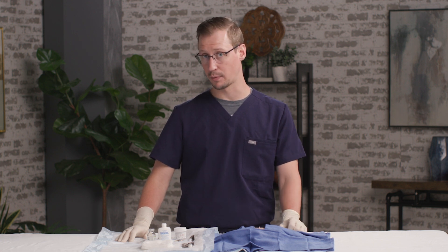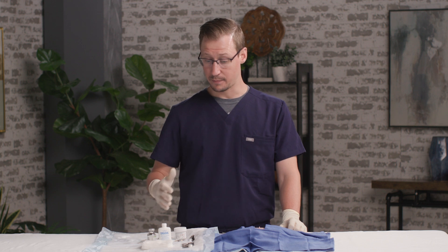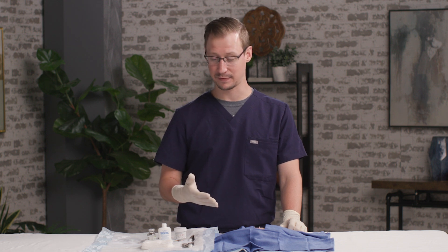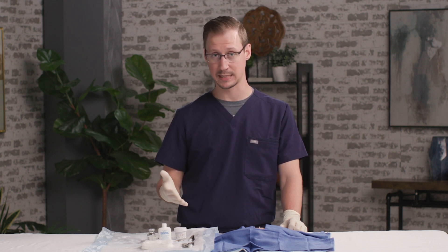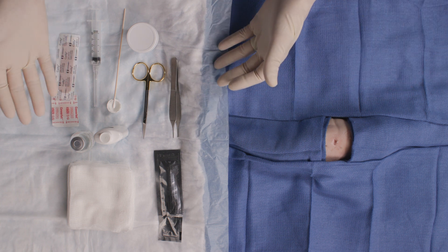This is a really straightforward procedure — the snip excision technique. First, of course, we would do our informed consent like we do with every procedure. We'd talk through risks, benefits, and alternatives. And then once we have informed consent, we can get our tray ready. On my tray for snip excision, I want to have the following.